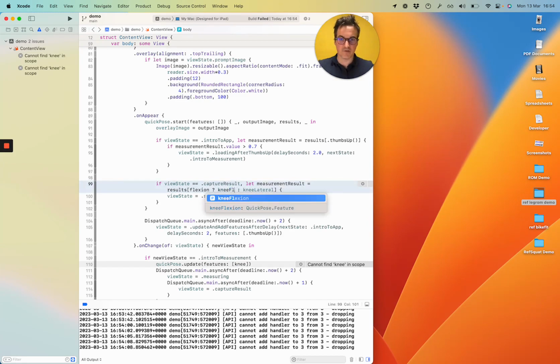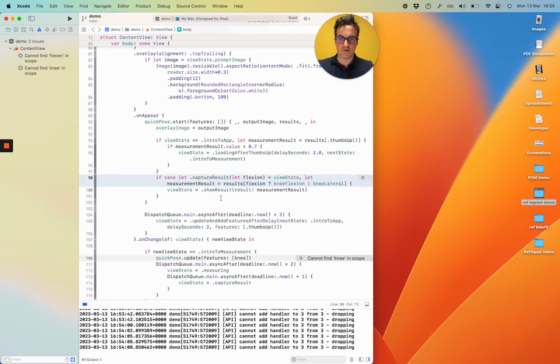If it is flexion, I'm going to check flexion value, and we have to get the flexion value from this. So this is a feature in Swift enums which allows you to cast the value like this. There's a case let capture result flexion. I'll probably want let flexion from the view state. So let's try that. Cool, okay. So it's taking the flexion value from the state and then saying which feature do I want the result from. This show result shouldn't technically work, so I'm going to pass in the flexion value here.